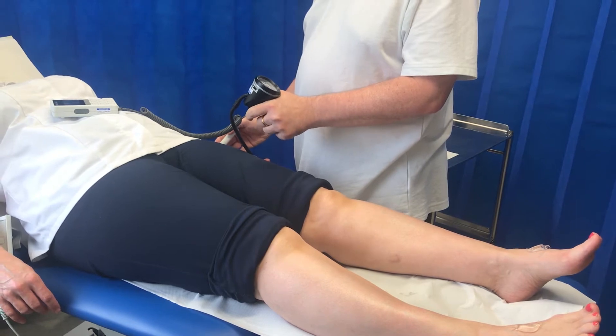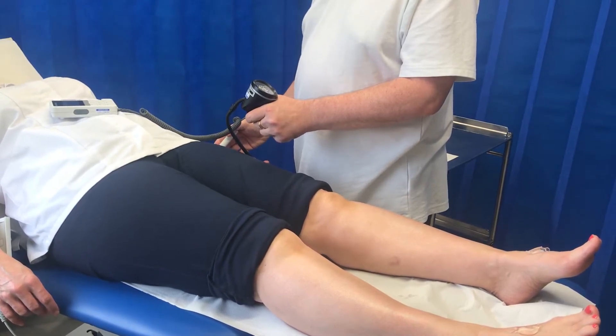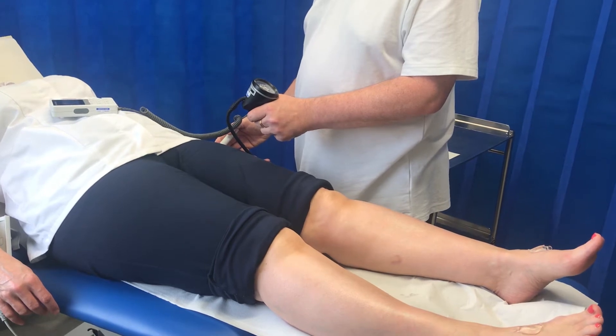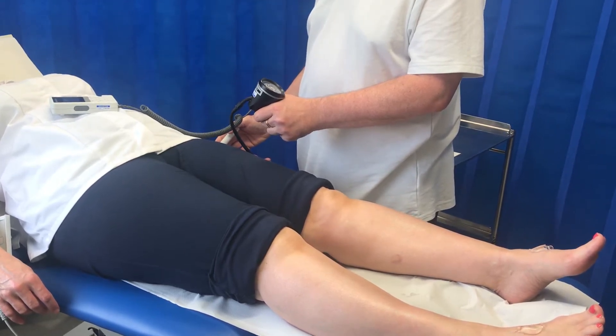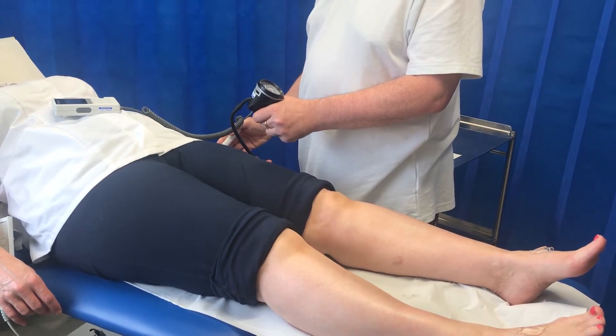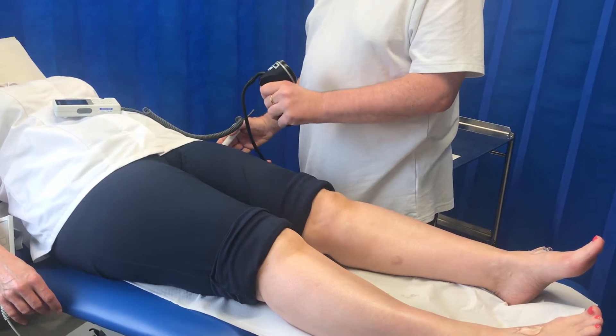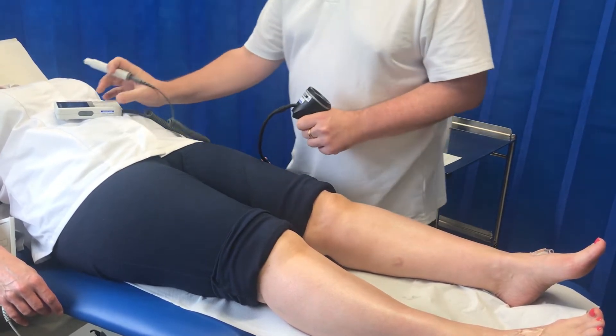I'm going to inflate and listen up to about 120, 140, a bit higher — the pulse is now gone. I'll get my finger on the trigger and deflate slowly. Waiting for the first sound, then deflate completely and make a mental note of that sound.